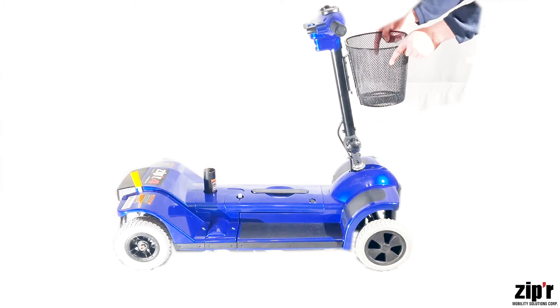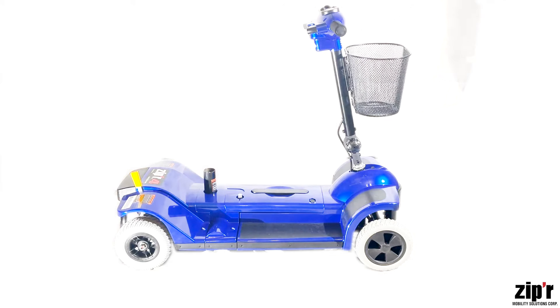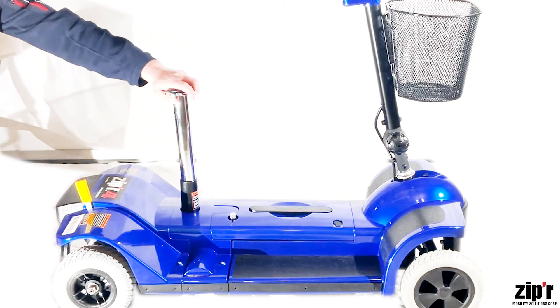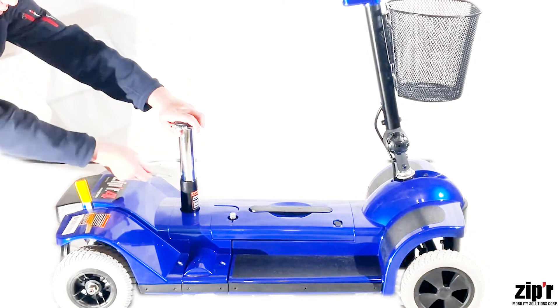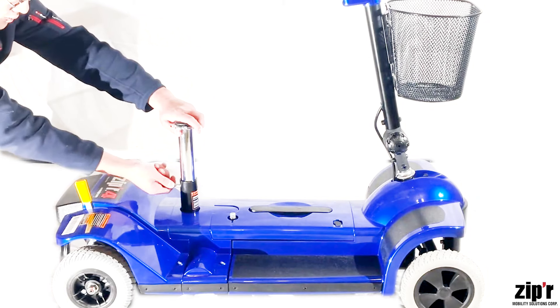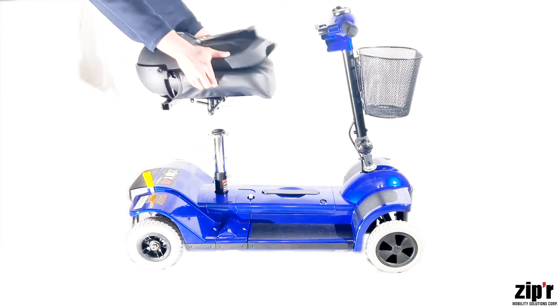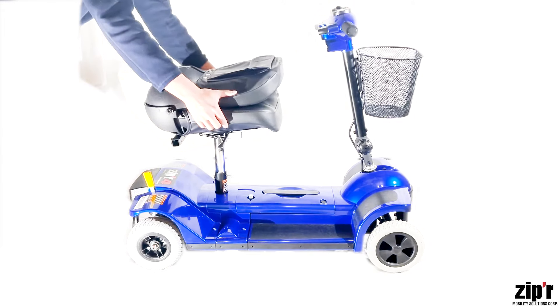Now let's attach the basket. Secure the seat post by inserting and locking the seat post pin to your desired height. Insert the seat by aligning the seat post to the seat.